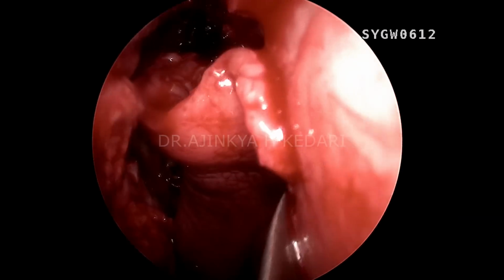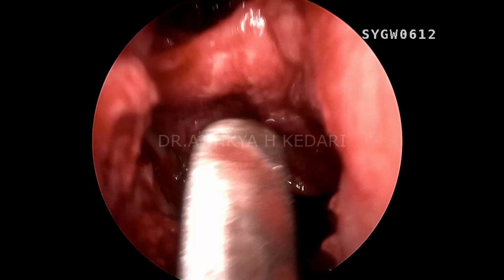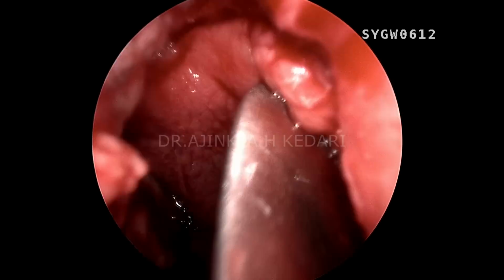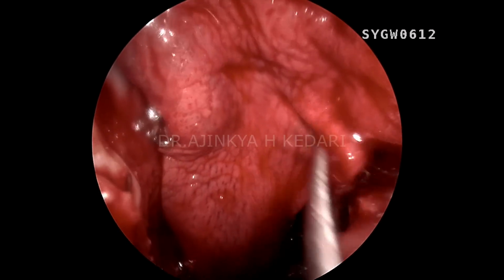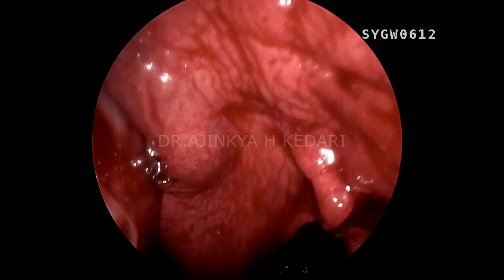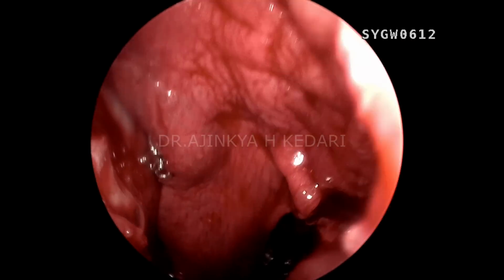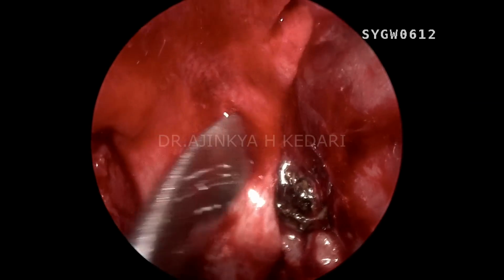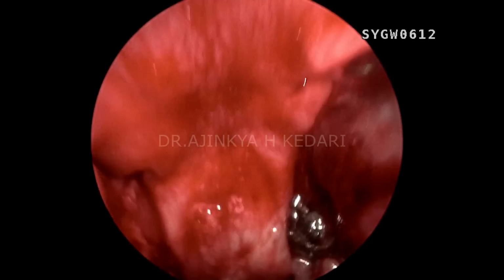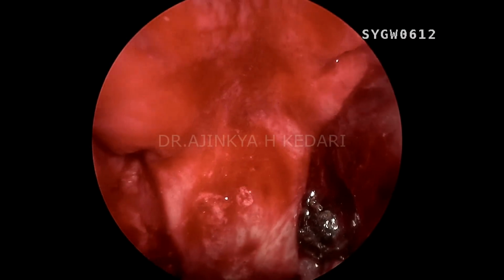So you can see I'm now rotating that, making sure I keep the proper layer facing towards the leak site, making sure I do not obstruct the frontal outflow at all. So you can see that's a huge Hadad flap covering the primary and the secondary leak site, making sure also to not obstruct the sphenoid sinus opening.